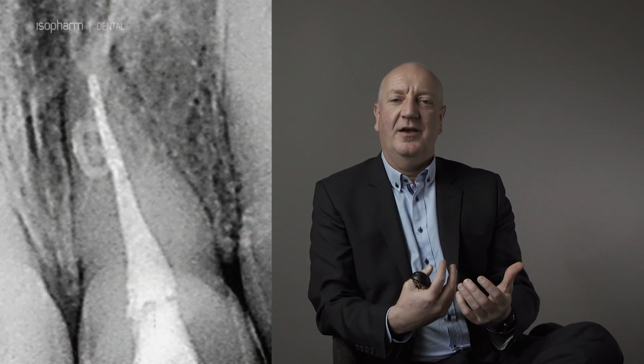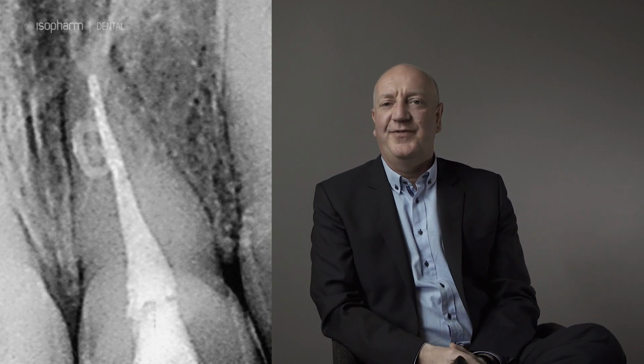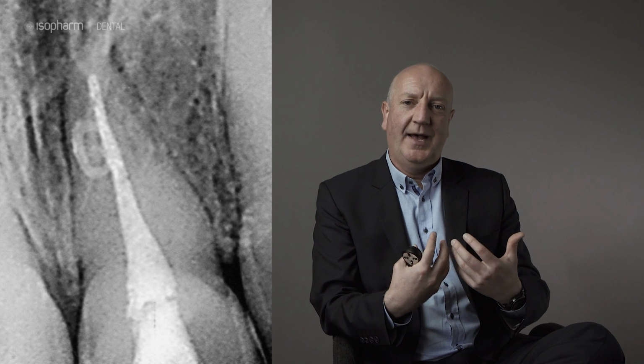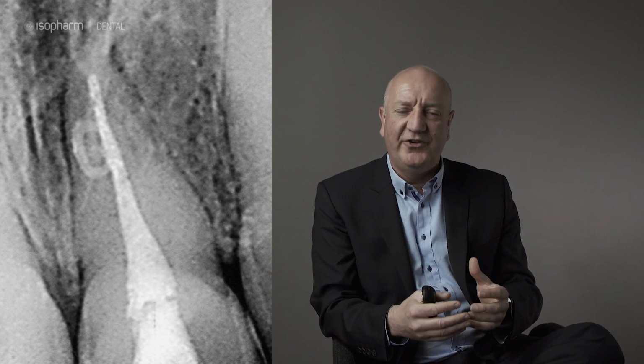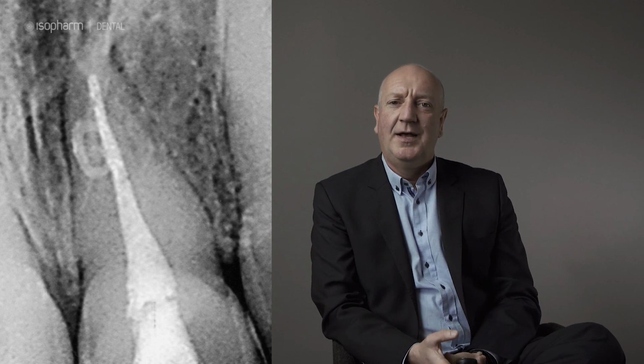Tip 8 is around obturation. Now, as endodontists, we obturate root canals in order to create a nice coronal to apical barrier, as many layers as we can to prevent reinfection of that root canal. So it starts with your crown and your core material, and then the layer of filling you've put over your GP, and then the GP provides that additional layer of seal right down to the apex.